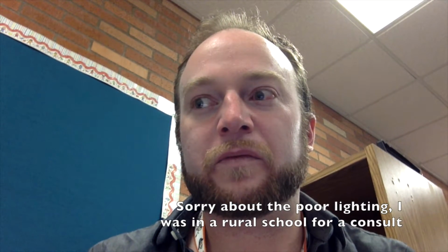So hi there, folks. I usually try to make the videos that I put on YouTube about accessibility as easy to understand as possible. We had a request recently using the app Avaz, which supports multiple languages, French, English, Spanish, etc., of how to use switch scanning to place diacritics, meaning accents, essentially, like the flip up, the flip back, the umlaut above the U in some languages. And it turns out with switches, that's actually not an easy thing to do.